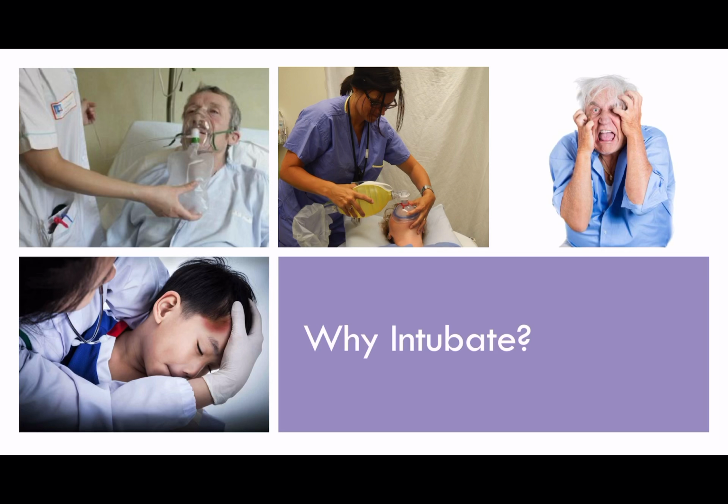So, thinking about why you want to intubate. This is not meant to be a comprehensive list by any means, but I'm just going through some of the more common reasons for intubating a patient. The most obvious, and probably the thing that most people think about when thinking of intensive care patients being intubated, is managing patients with respiratory failure.